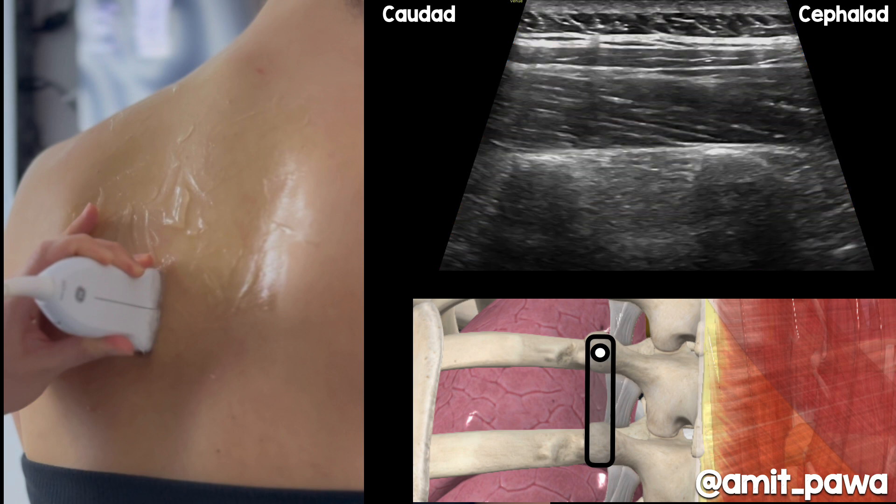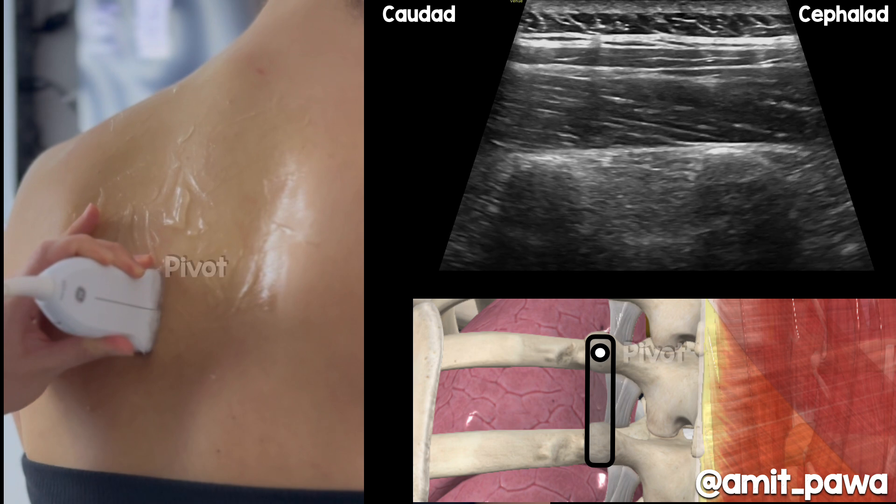To get a better view of the pleura for a paravertebral block, you've got two options. You can either remain truly paramedian sagittal and tilt the beam of the ultrasound ever so slightly laterally to get a view of the pleura. But I'm going to show you something else: how to pivot the ultrasound probe on the cephalad aspect and direct the caudal part of the probe laterally.